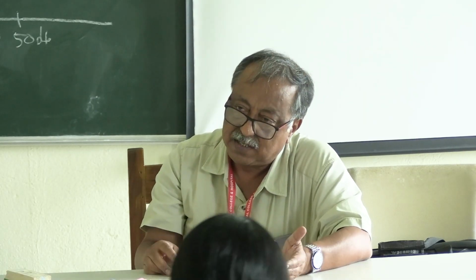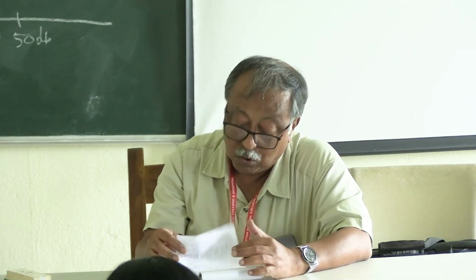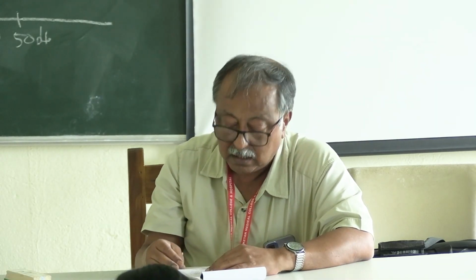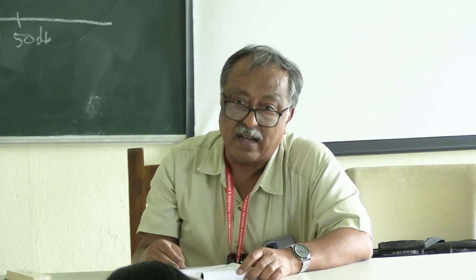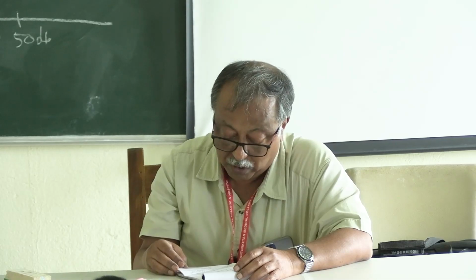Intensity is increased sometimes, 25 decibel or more. In retrocochlear lesion, decay is there. That is the tone decay curve, Carhart's tone decay curve.